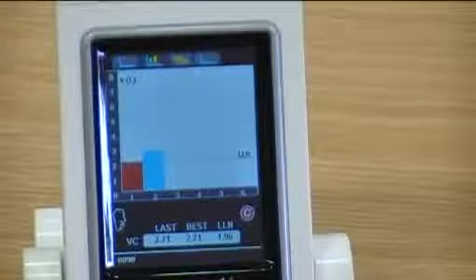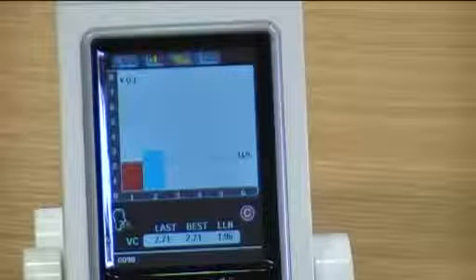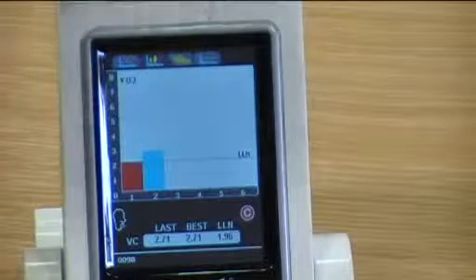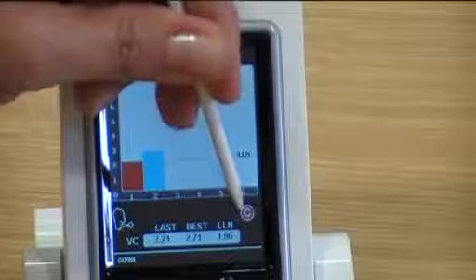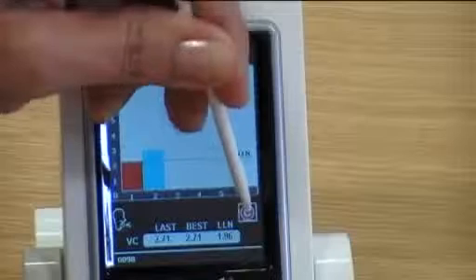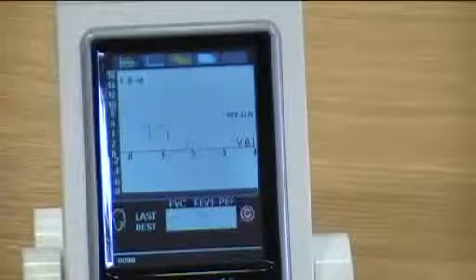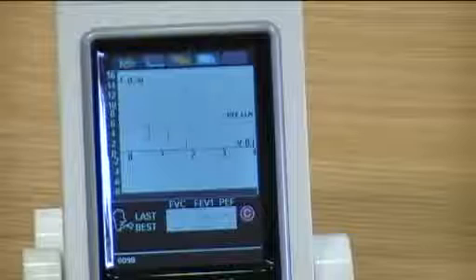Once you have two repeatable blows you can then exit from your vital capacity. You will press the cancel icon on the bottom right-hand side of the screen. This will now take you straight into forced vital capacity and you can commence your testing.